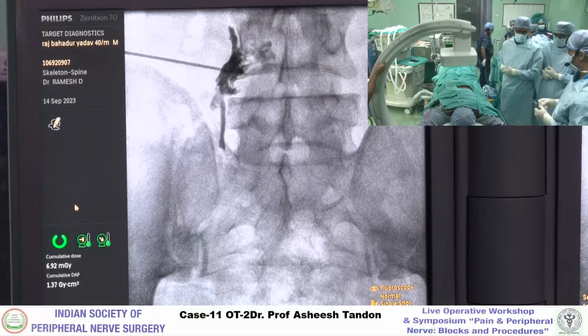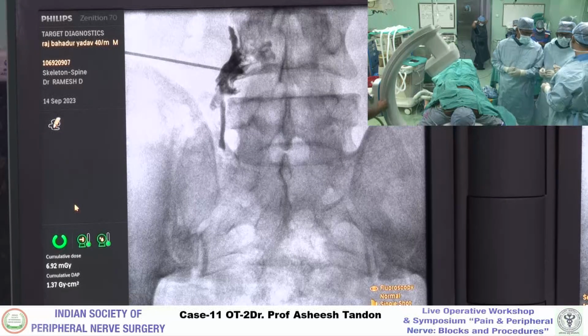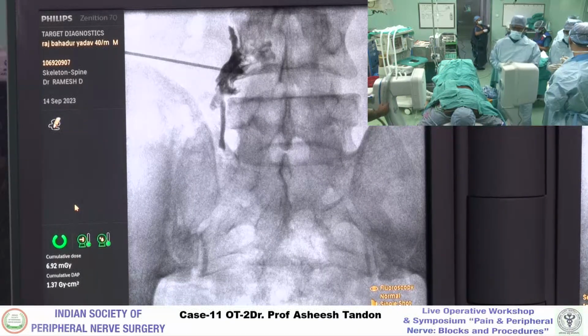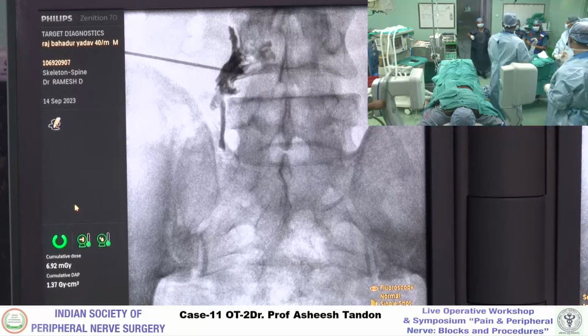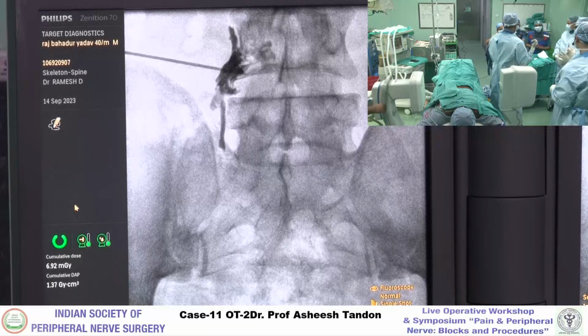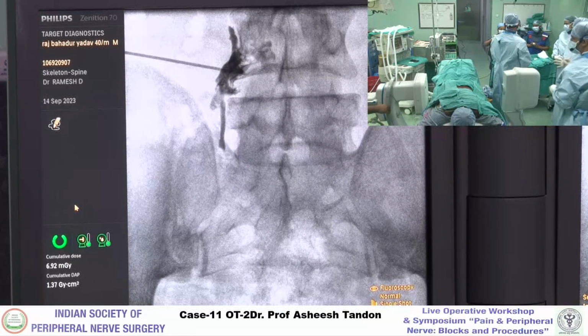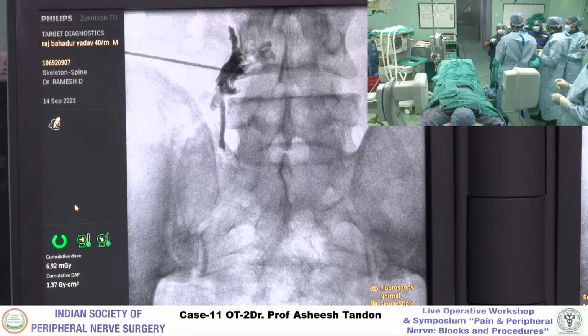Okay. 2 point. So this is 0.25, right? सेंसॉरकेन है ना सिस्टर, 0.25 है ना? सर दोनों OT में केसेस. Yeah, but the concentration you had taken was 0.25, right? इसमें हाँ, okay. राजेश मीना कर रहा है OT1 में, OT2 में. Okay, shoot.